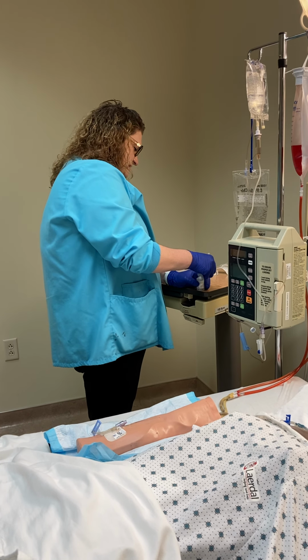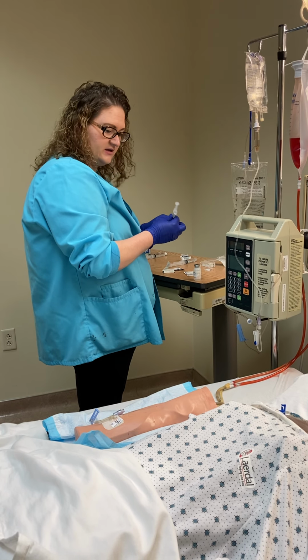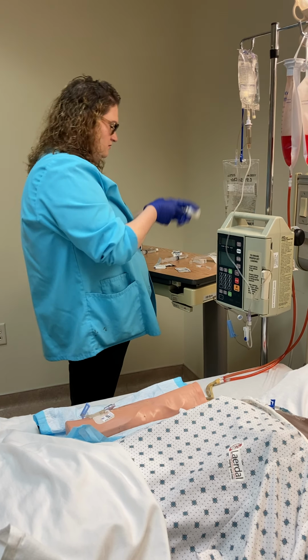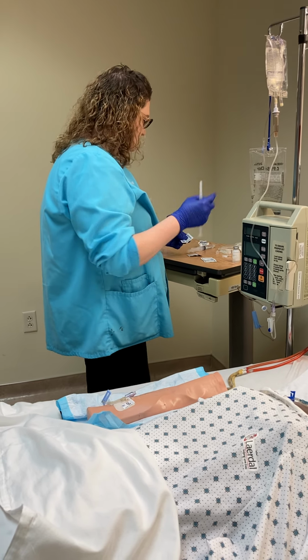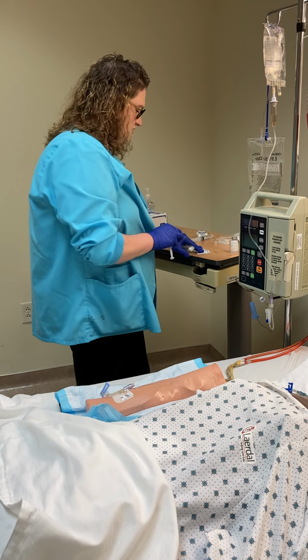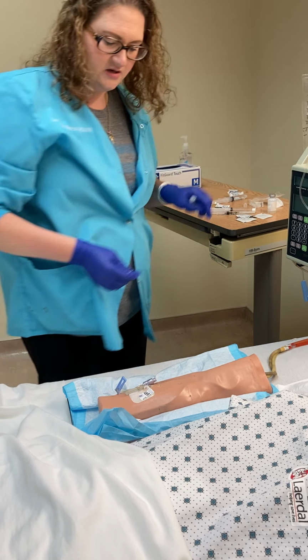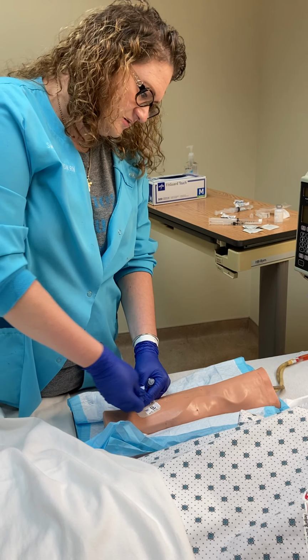So we scrub for 15 seconds. We've done our 3 checks. We've gotten our identifiers. We've scanned his band. We've scanned the medication. He already knows about this medication because he's had it already. And I'm going to go in and we will do our flush first and then our med. So 15 seconds of cleansing.